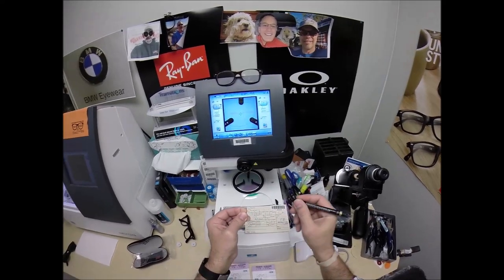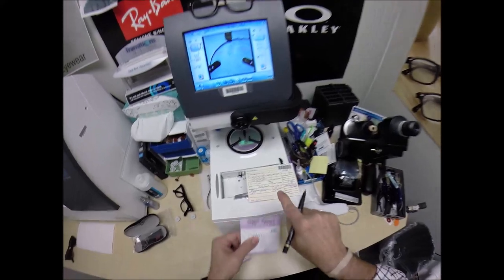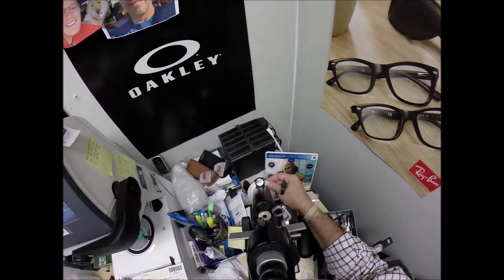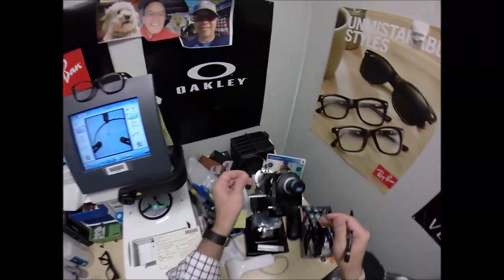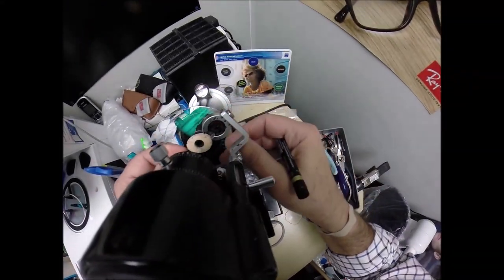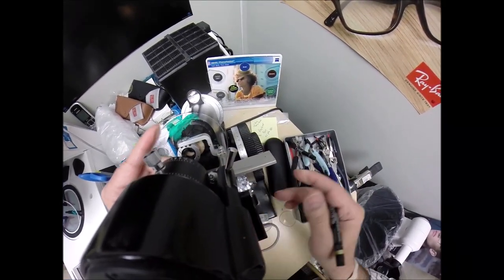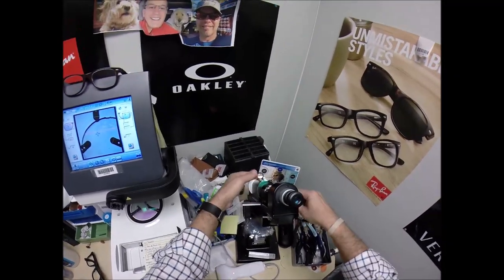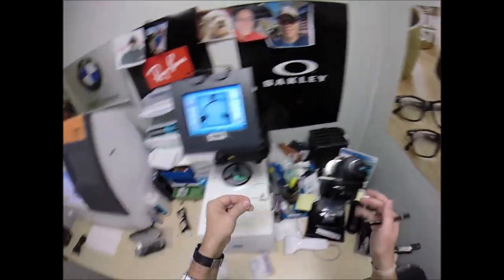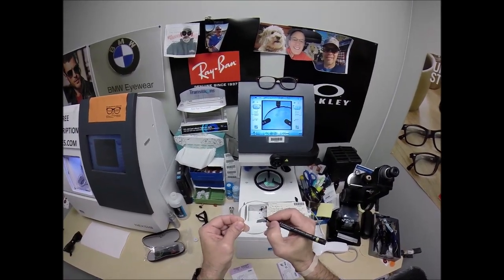Same thing for the left lens: minus one minus fifty at 15. Turn the axis wheel to 15, put the lens in — still on minus one — and rotate until the spherical component of the prescription, the minus one, comes into view. Put a dot on there, and on there, and on that one.